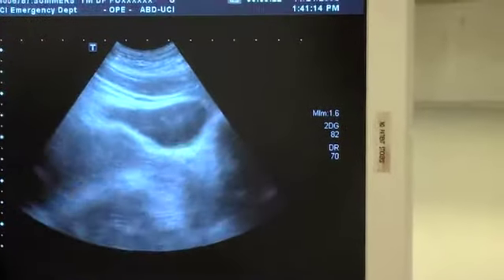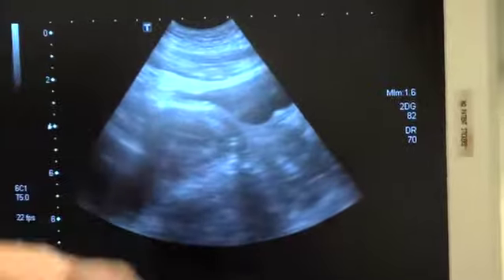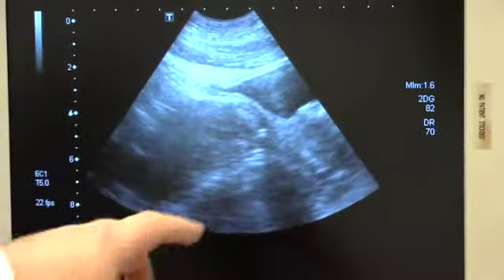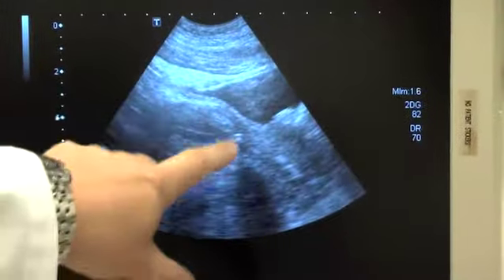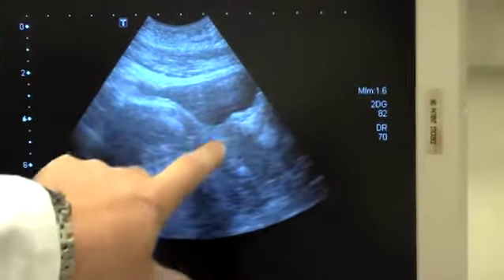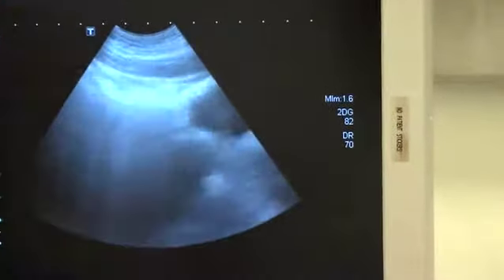It's a little bit difficult on her because you need to have a completely full bladder to get a good transabdominal view of the uterus. But this is the fundus of the uterus. This is the cervix down here. The vaginal stripe is going to come up like this. This is to the patient's head. This is to the patient's feet. This is anterior and this is posterior.